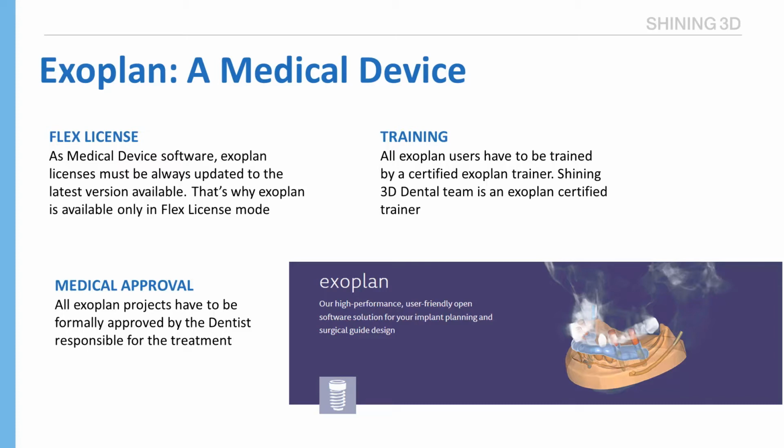Last but not the least, when we say that EXOPLAN is a medical device, we mean that projects and restoration edited with the software are actual treatment plannings which have to be formally approved only by the dentist responsible for the treatment itself. In case you need any clarification on any of these aspects, we can for sure clarify any doubts during the Q&A sessions at the end of the webinar.